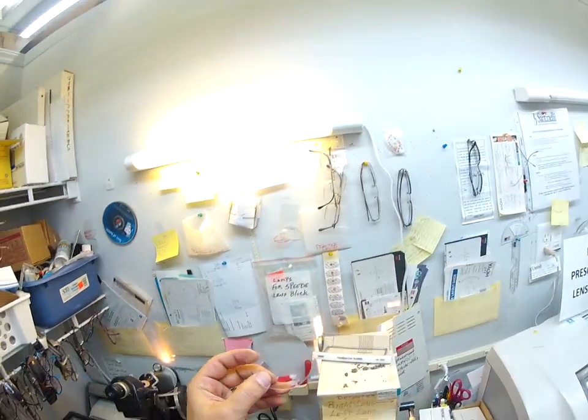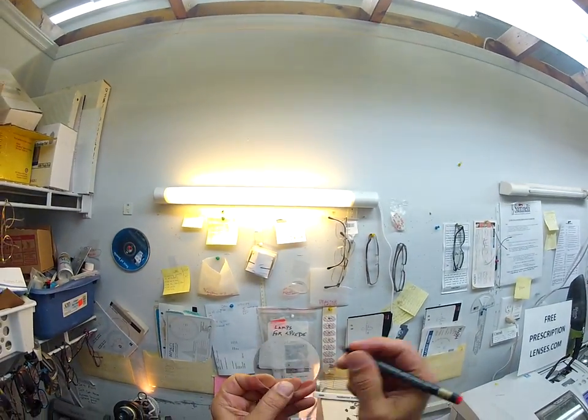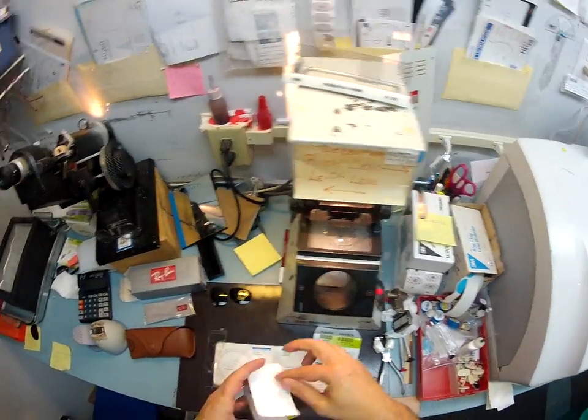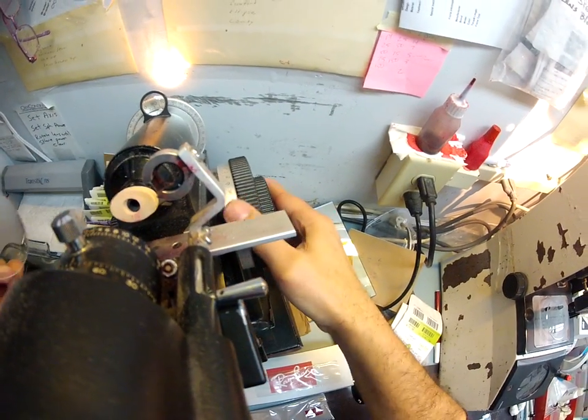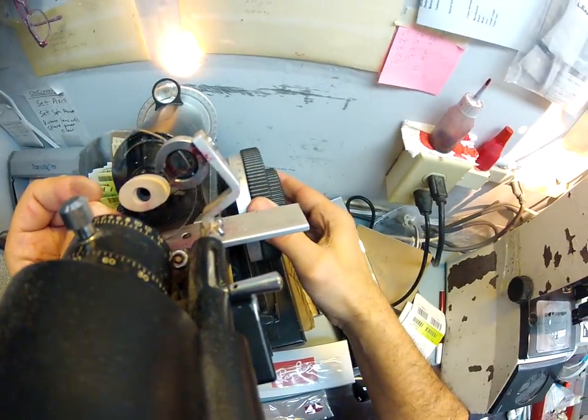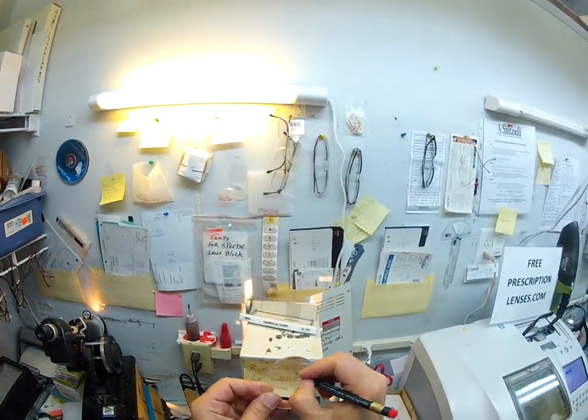I'm finding the optical center of the lens, I'm going to put a big red dot there and mark that for right. Let's do the same thing for the left — find the optical center of the lens here in my Marko 101 lensometer, dot that up, and that's marked left.